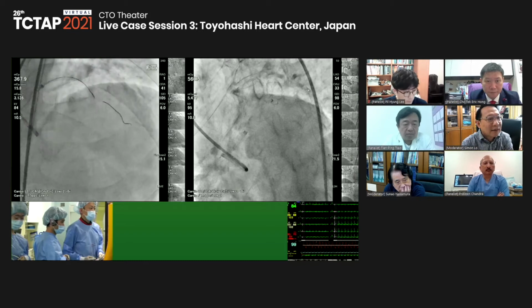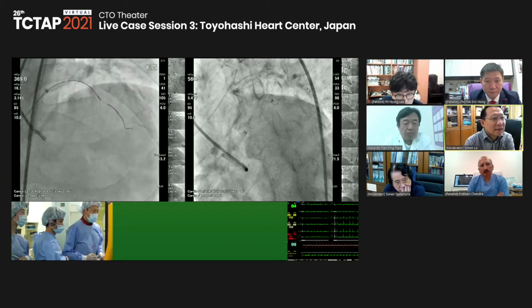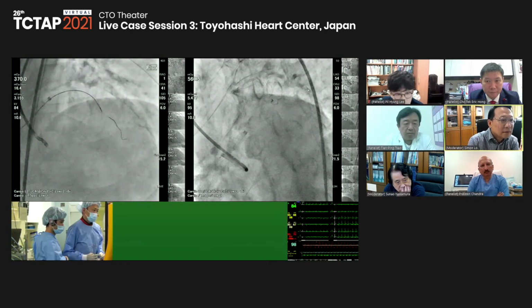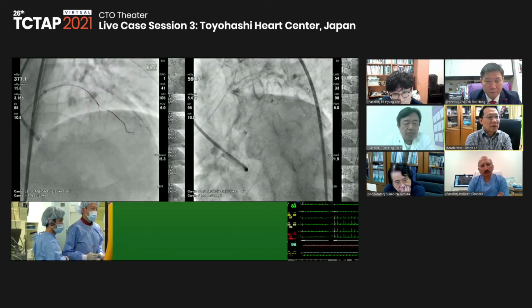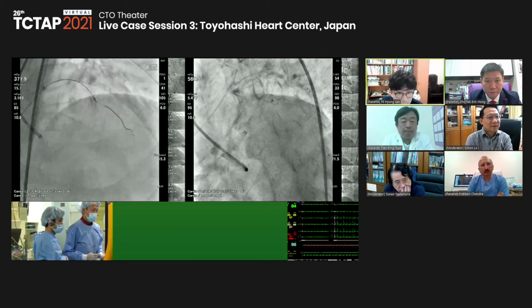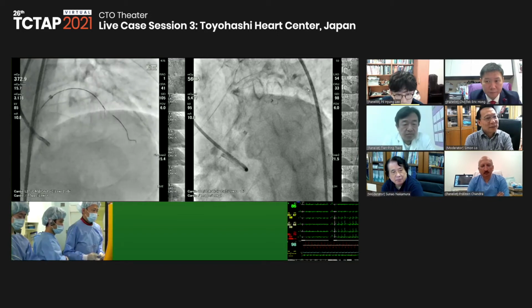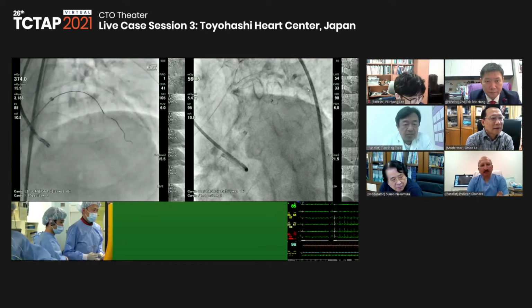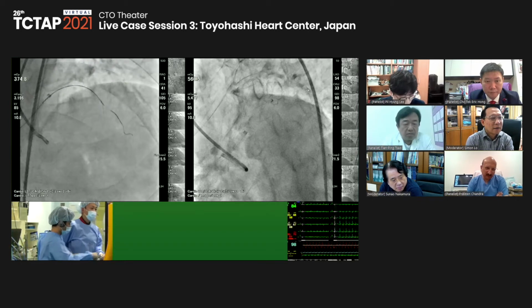This is a DLC Sasuke. Looks good. You have some progress, right? Yes, but I have some resistance here. Okay. I think this is the LAD direction.